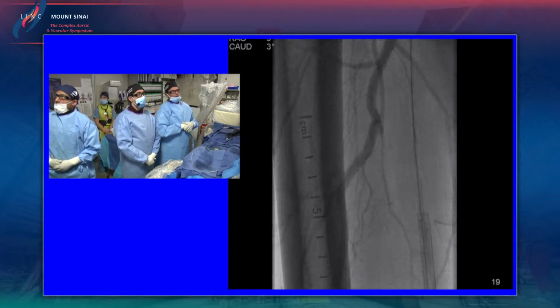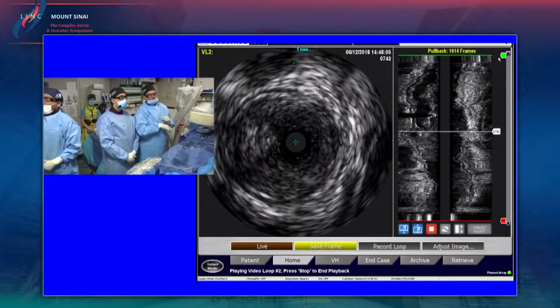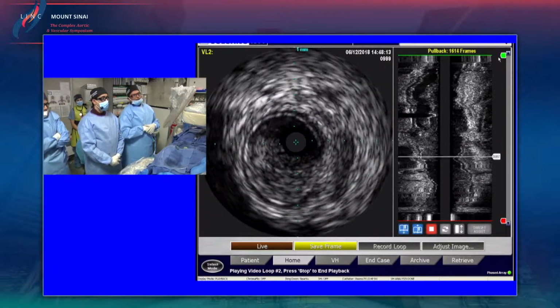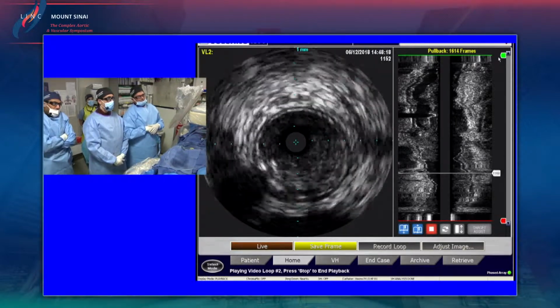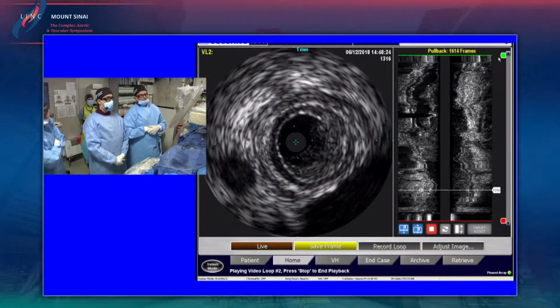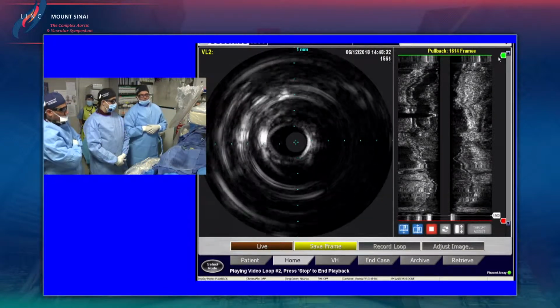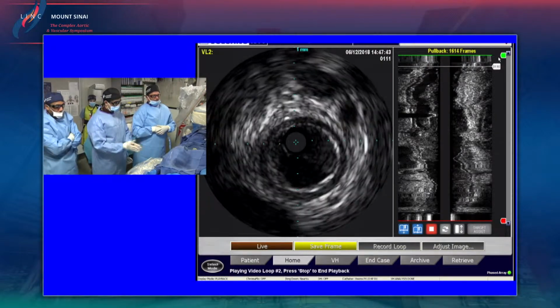Yeah, sure. And when you see the IVUS, you can see that distally we've now got a much bigger channel. However, the dissection planes are there from the crossing that occurred, but you can see there was a lot less clot burden, especially in certain areas. And then when we start getting into the stent, again, you see you still have that layered thrombus, which worries me a lot. And so at this stage, I wanted to pick the panel's mind and see what they would do. I think in my mind, at least, the options would be to lyse this patient or to go ahead and do intervention with a balloon angioplasty or laser or something like that to see what happens. So I was just curious what the panel thinks and what they would do in this kind of situation.